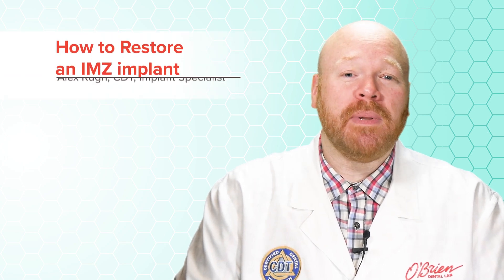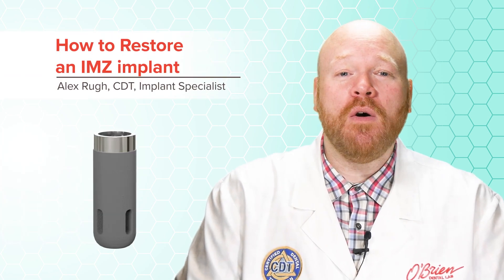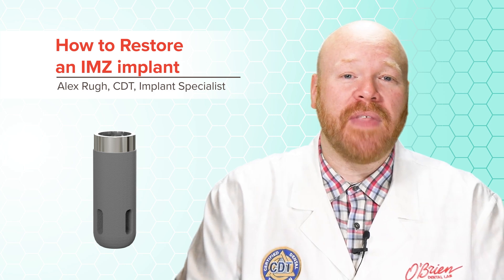Hey everyone, Alex from O'Brien here. Restoring older implants can be difficult, especially when most of the restorative components have been discontinued. And this is definitely true for the original IMZ implants, and in this video I'm going to go over the restorative options you have for that system.